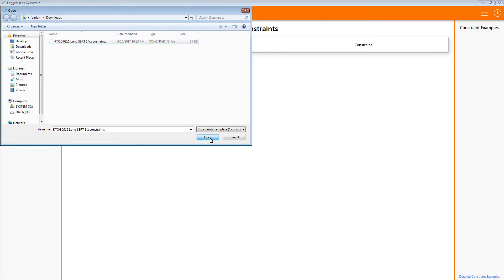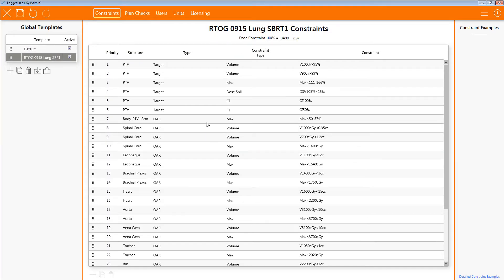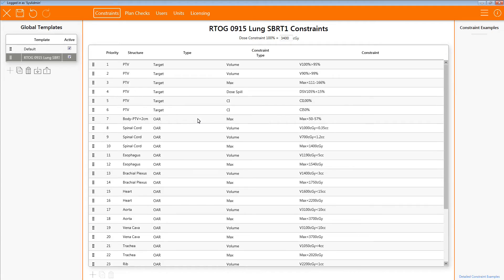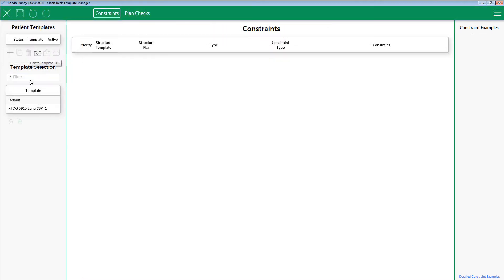Browse to where you saved the constraint template file, then click Open. That's it. You now just imported the constraint template into the ClearCheck administration application. Next, verify that the constraints are correct. At this point, feel free to edit the template name, add constraints, edit constraints, or whatever else you deem necessary. Now when you open the Patient Template Manager, the constraint template will appear here because it was imported via the ClearCheck administration application.